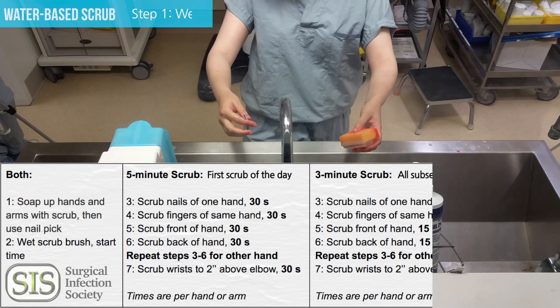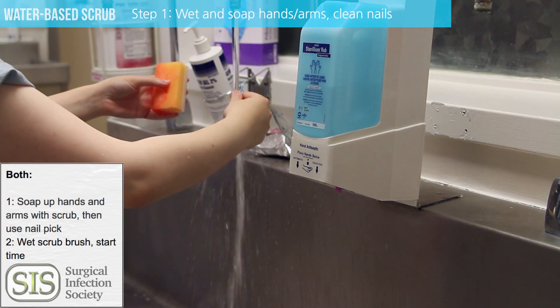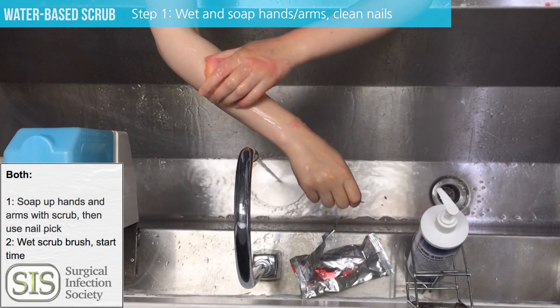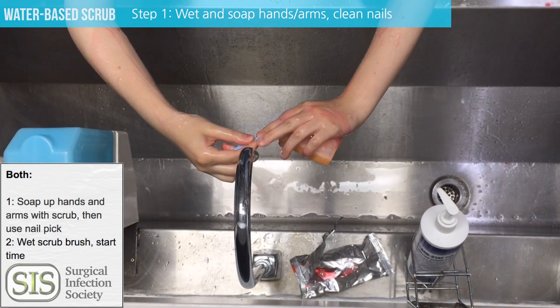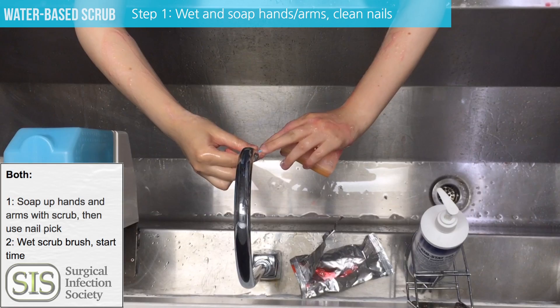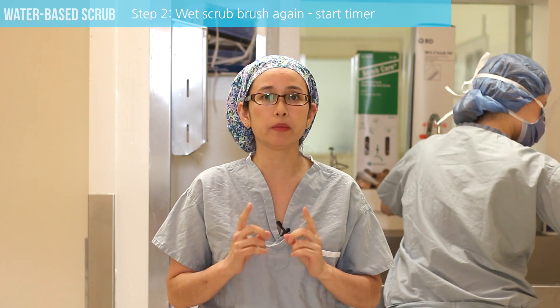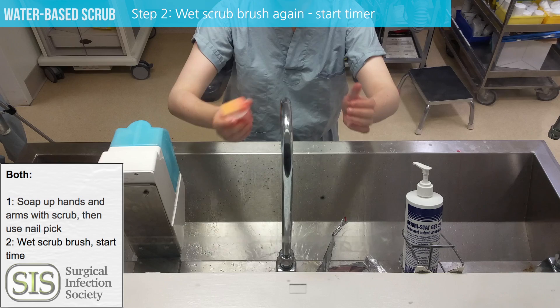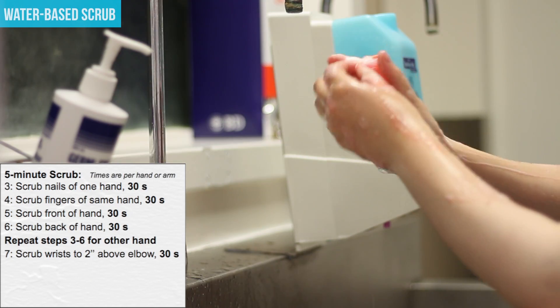Step one is to clean the fingernails. To do this, wet your hands with soap and water and clean all of your nails free of debris. You don't have to do this step any other time of the day unless they're visibly dirty. Now wet the scrub brush — this is where the timer begins. Wet the brush, start the timer, and now scrub your nails for 30 seconds.